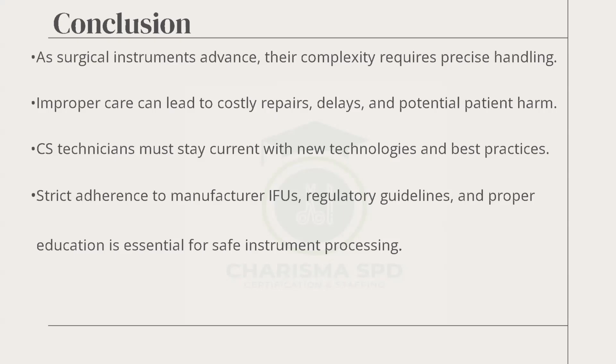The IFU of the manufacturer is at the apex, at the top before all other protocols. So always follow the IFU of the manufacturer, and if you do that, you increase the lifespan of these instruments. You save the hospital a ton of money.